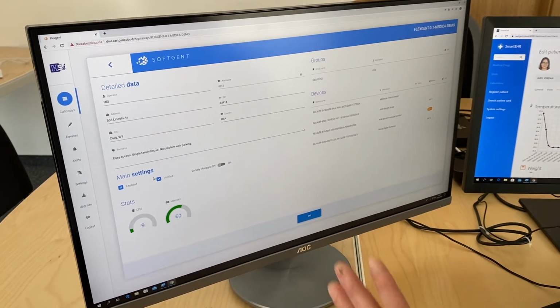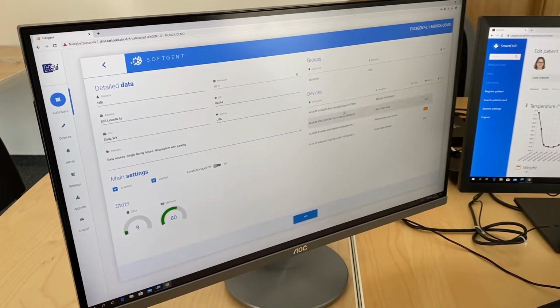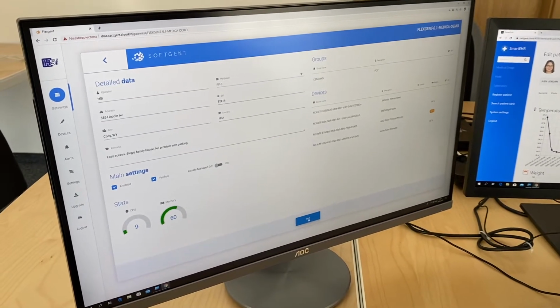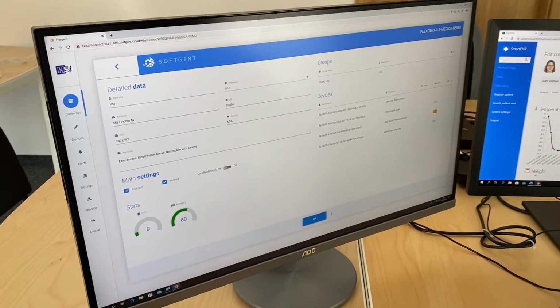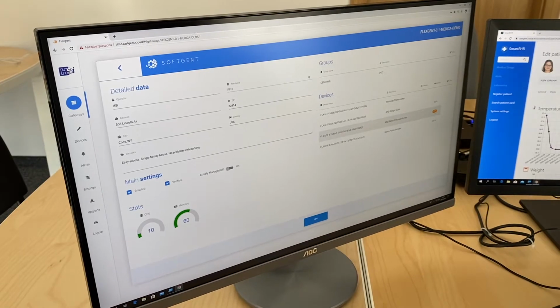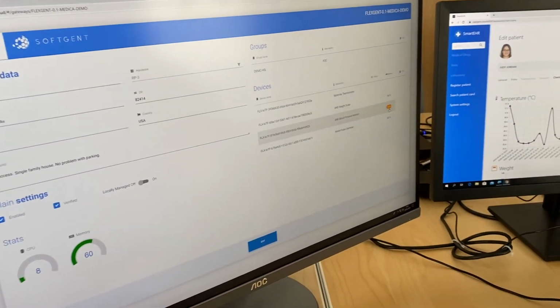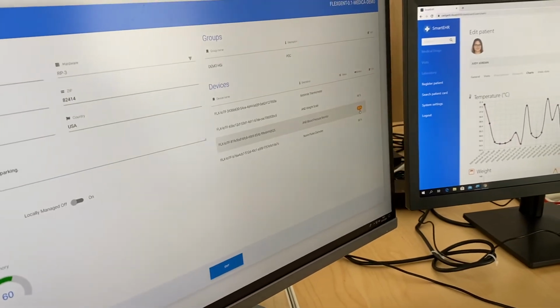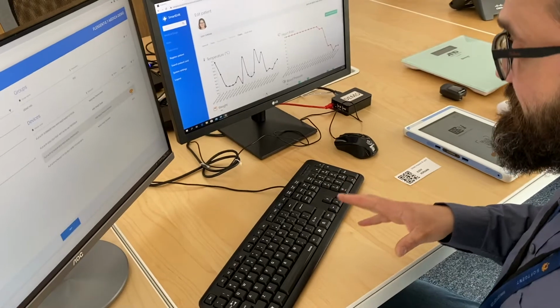So I'm getting into details of this gateway, and I can learn right away that the gateway has been provisioned with several devices. Of course, if I go into edit mode, I can add and provision more devices, but for the sake of this demo, I have 4. You see that I also have some indicators about the health of these devices. So you see 30% of a battery means that maybe I need to take an action and change the battery on it. So I have this information in our hospital IT system.